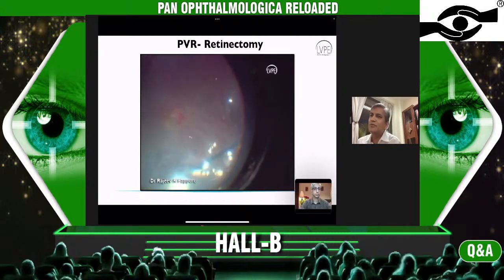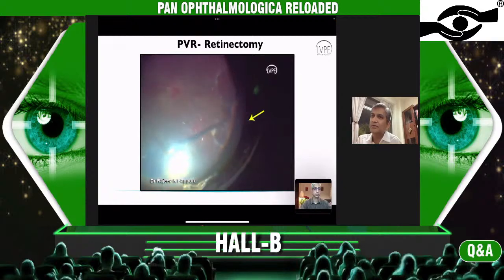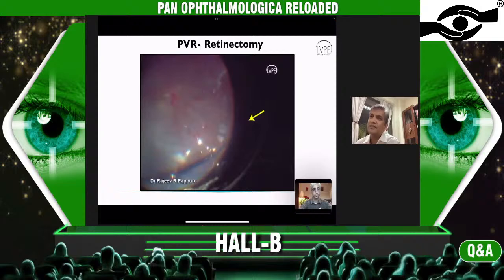That's where you can go there and extend the retinotomy a little more, so that you can settle the retina without causing much problem, without causing a tear. So there's controlled retinal attachment, and extending the retinotomy where required is important.